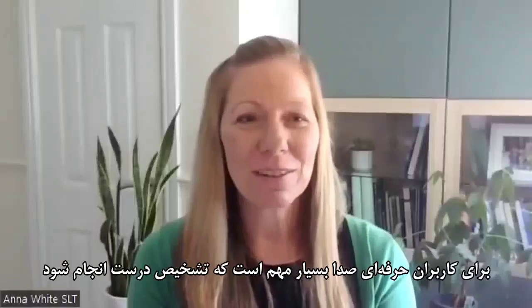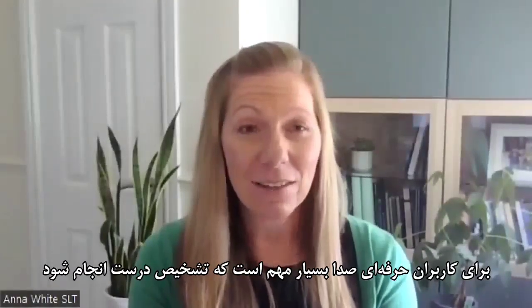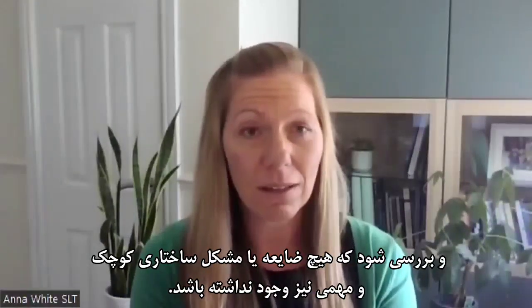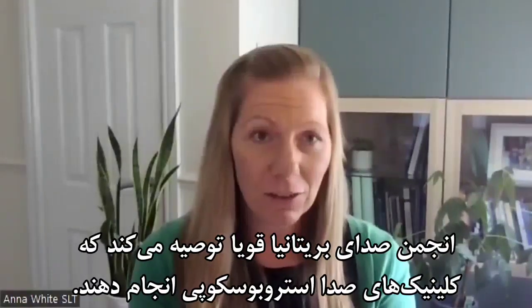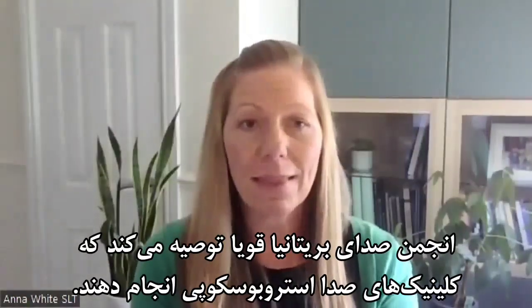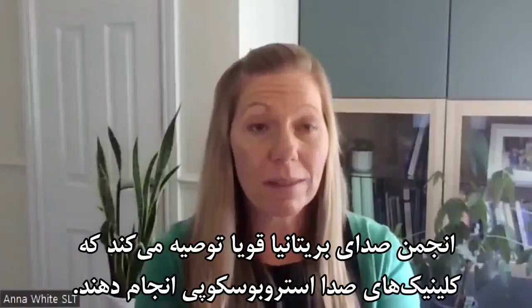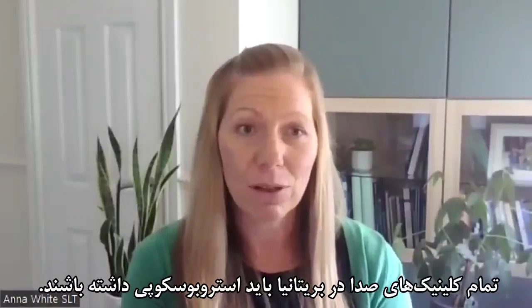For a professional voice user, it is so important to get that diagnosis right and to check that there are no subtle lesions or subtle structural problems. The British Voice Association strongly recommends stroboscopy for a voice clinic. Any voice clinic in the UK should have stroboscopy available to them.